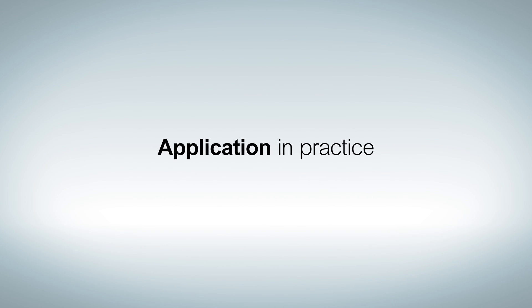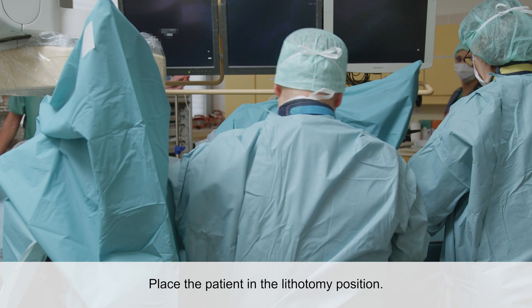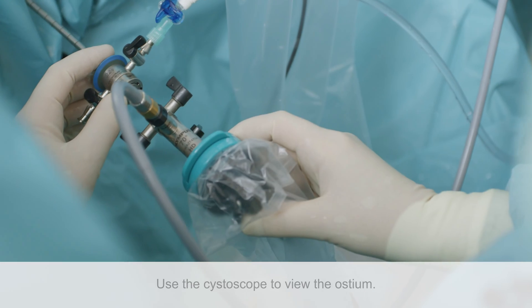Application of the Uromed HydroPore Ureteral Stent. The patient is prepared for the procedure and placed in the lithotomy position.